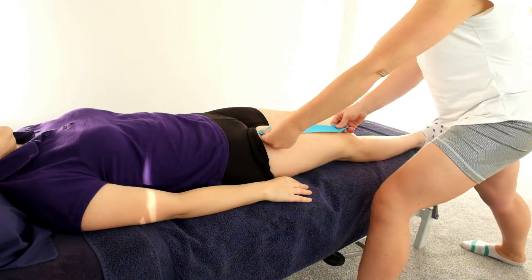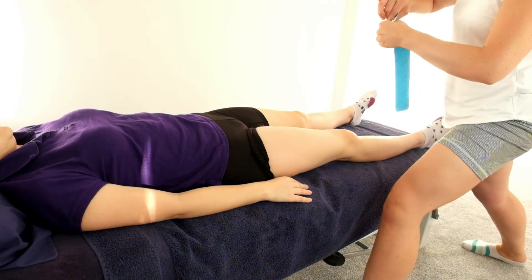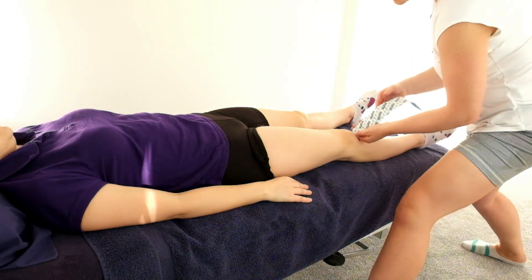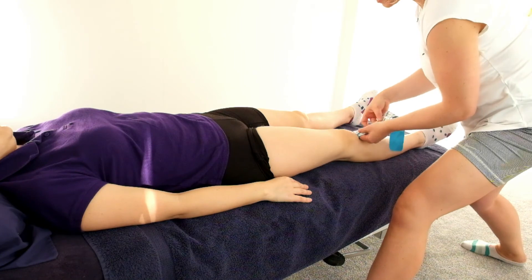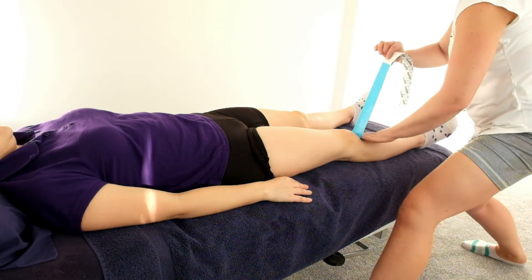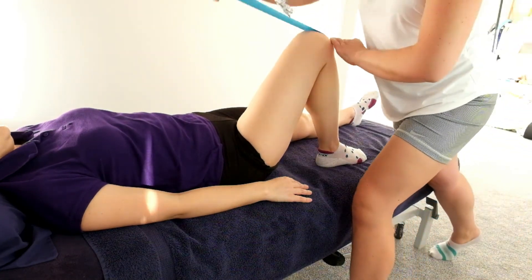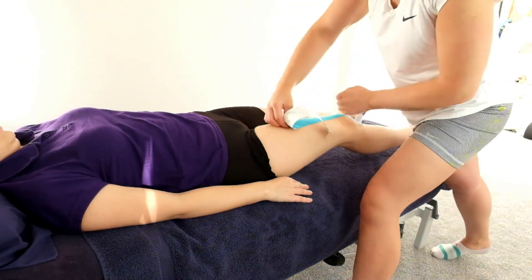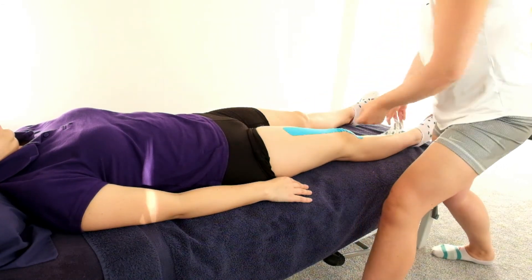First of all, inhibition. We need a good long piece of tape — make sure that you measure it. It's an inhibition, so we're going to anchor below the knee at that tibial tuberosity. Anchor with no tension on the tape, no stretch on the tissue. Peel back the active part of the tape and add a light amount of stretch. Get your client to flex their knee, put the tissue on stretch, and rub that tape down with a light stretch on it. Relax the leg, relax the tape, and rub well to stick.